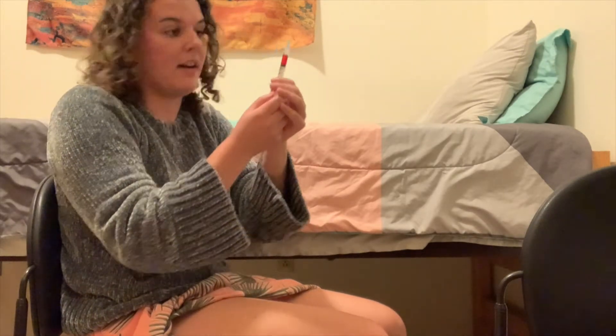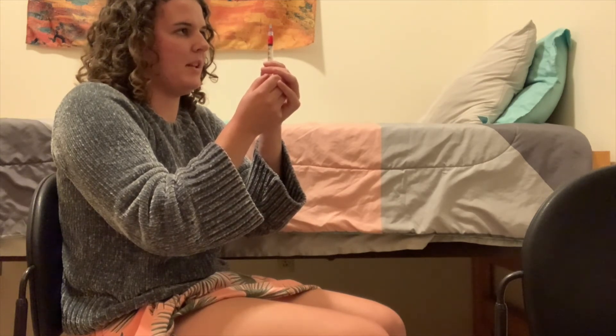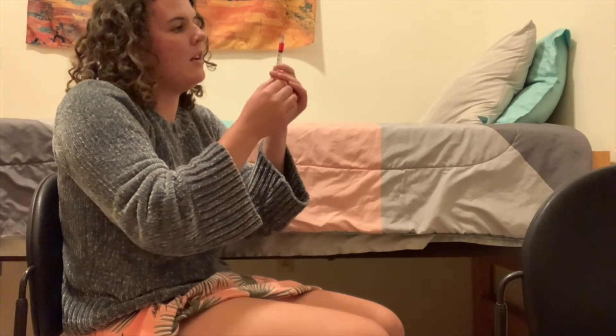Now that you have your one milliliter in your syringe, just push out the excess air until the liquid is all the way to the top. You'll notice that once it's to the top, it'll start coming out of the tip of the needle. We want to make sure that we're not injecting air into ourselves, so give it a few flicks to get all of the bubbles to rise to the top, then push it up a little bit more. Keep doing this until all of the air is out.